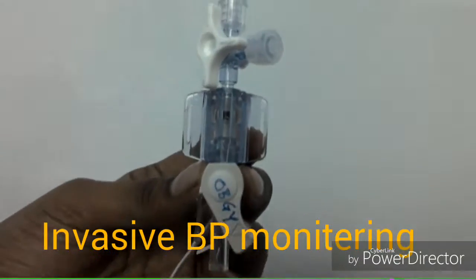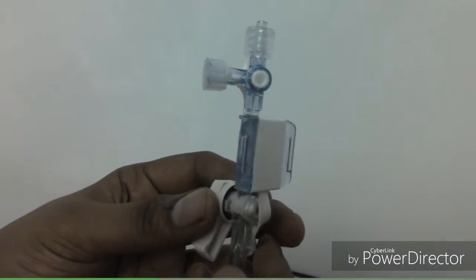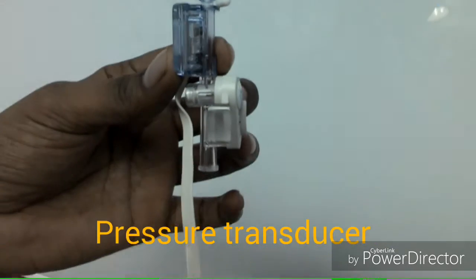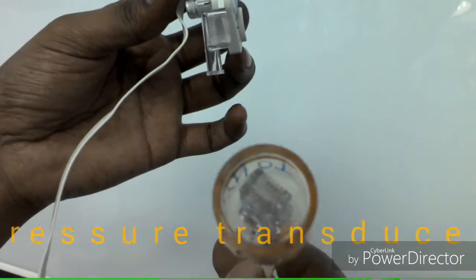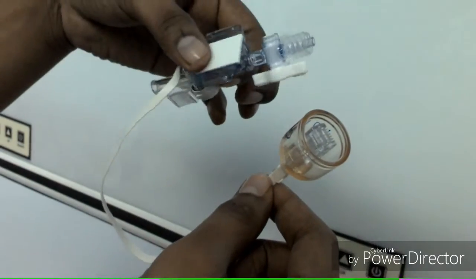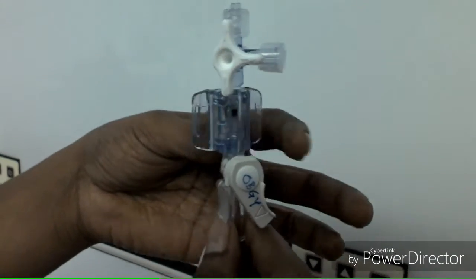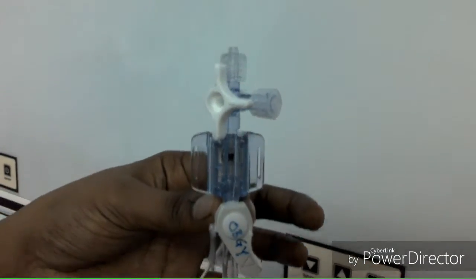Both gas lighter and pressure transducer work on the same principle: the piezoelectric effect. The piezoelectric effect is the appearance of an electrical potential or voltage across the sides of a crystal when you subject it to mechanical stress. The crystal becomes a kind of tiny battery with a positive charge on one face and a negative charge on another. Current flows if we connect the two faces together to make a circuit.